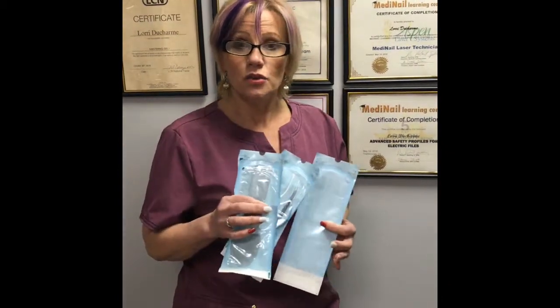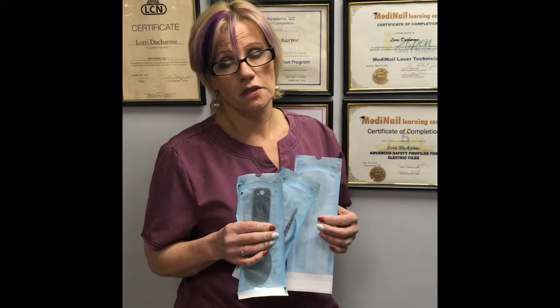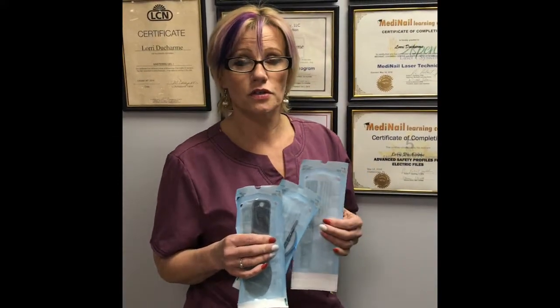You're seeing salons now starting to use implements that have been put in packages just like this, but the difference is: are they being run through the right kind of equipment to sterilize them — not just disinfect them? We use an autoclave, which is a high-pressure steam sterilization — the same thing that a dentist or a doctor's office uses to sterilize metal tools and implements.